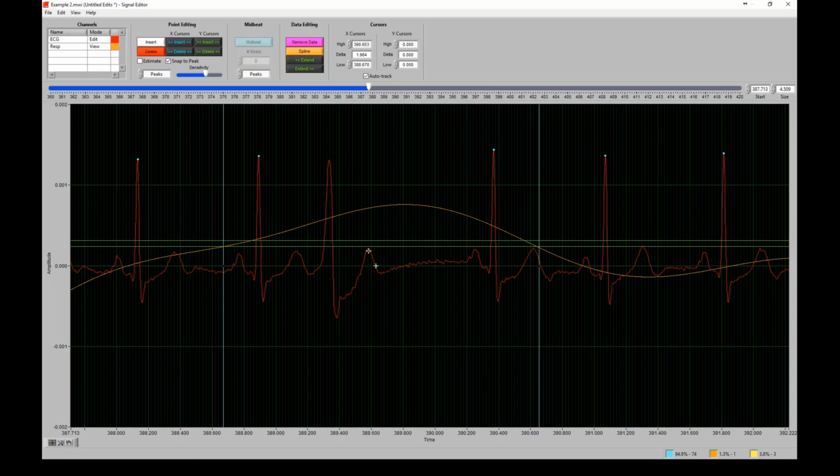We're not using these to identify specifically what the arrhythmia is. Most of the time, we're not trained in identifying those arrhythmia, and additionally, we're only looking at a lead 2 configuration of our ECG. So we would need to look at multiple perspectives on the beat, on the heart, to really identify this is what the arrhythmia is. But it's not important for us. We don't care what it is. We just care that it happened and that we're removing its influence from our statistical output.